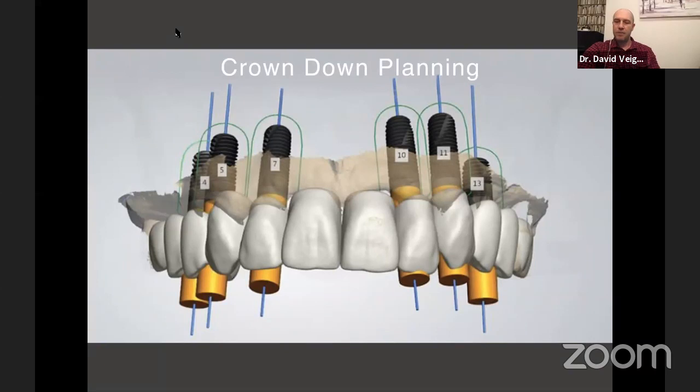And if the patient comes in with a dentureless situation, there's no sense in my mind about planning where the future implants are going to be without first knowing this setup. I want to know where that future incisal edge is going to be, so then I can plan what type of restoration I'm going to provide, whether it be an FP1, FP2, FP3.